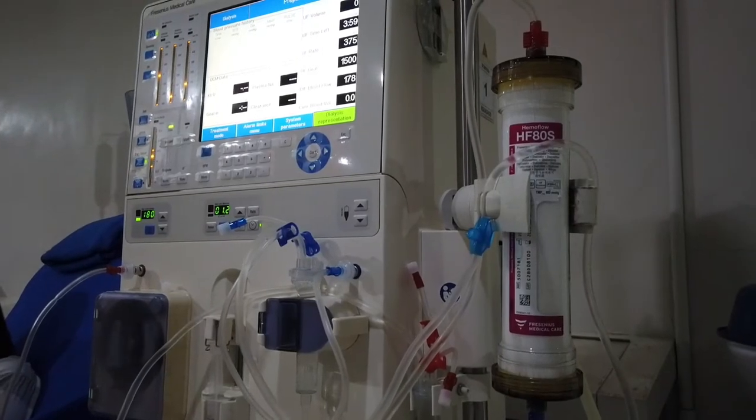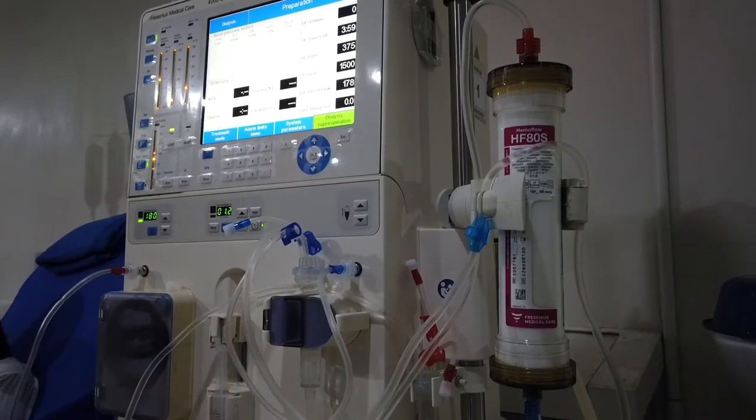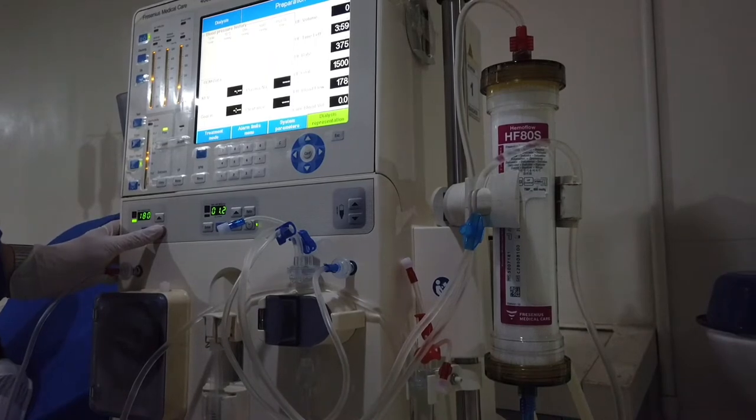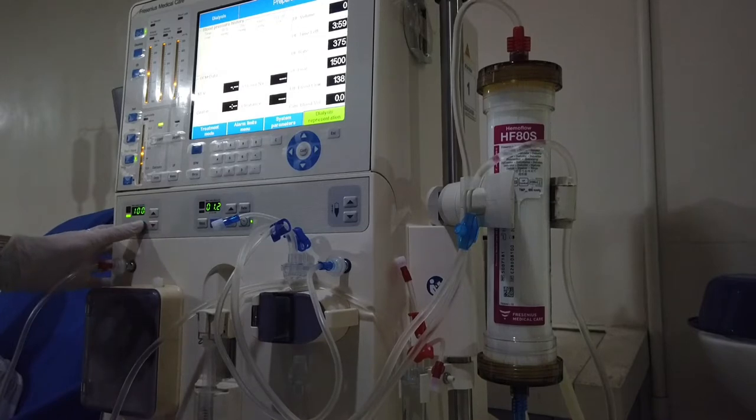The machine is now done with UF recirculation. In our facility it's 300 ml UF in 6 minutes, so you're ready to hook this to the patient. Lower the blood flow rate to 100 ml per minute, then stop the blood pump.